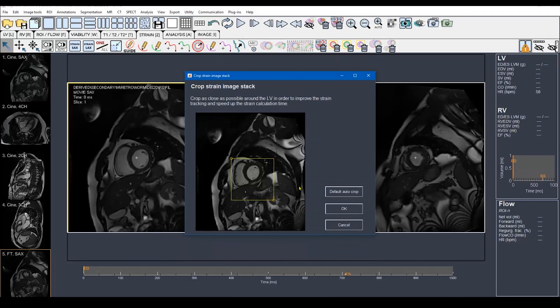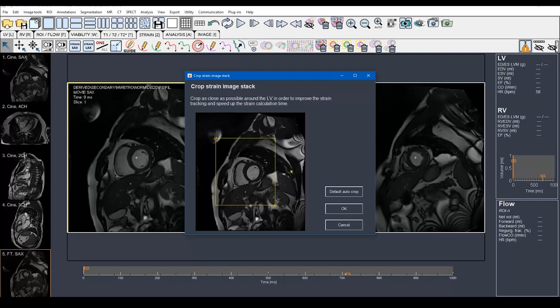This is the crop box I need to adjust. The trick behind adjusting this crop box is not to make it too small or too big. Making it too small will lower the image resolution and the image will pixelate. Making it too big will improve the image resolution but will cost a lot of time, because the software will register each pixel inside this crop box — tracking the motion of each pixel during the cardiac cycle. So I will adjust my crop box somewhere in between and then press OK.